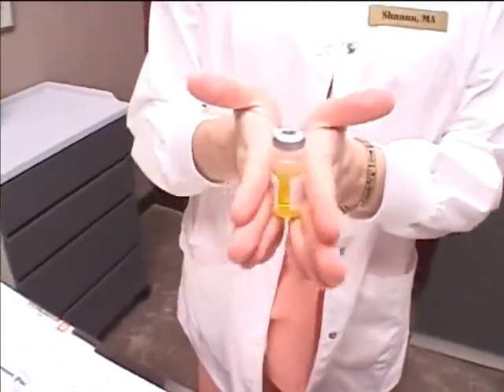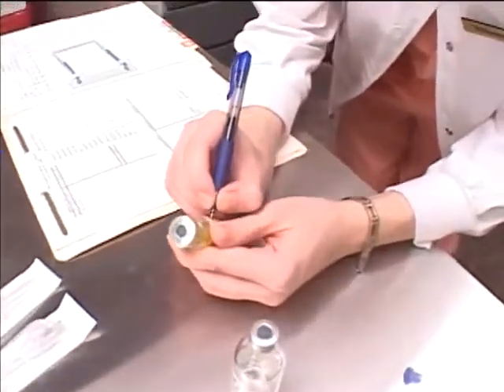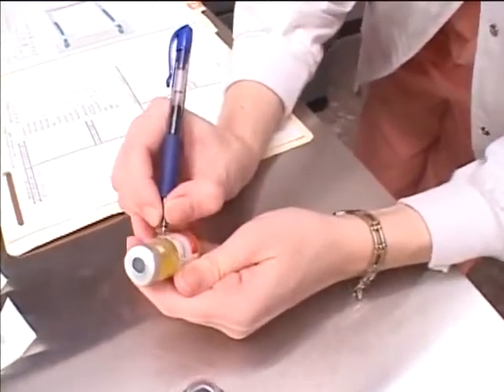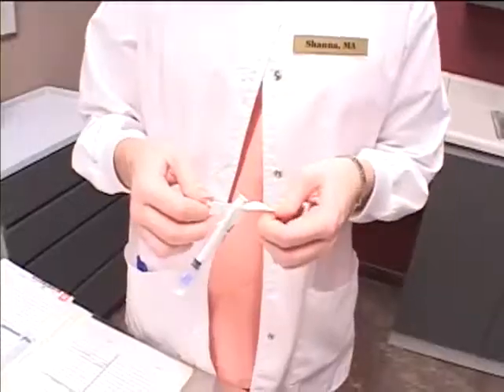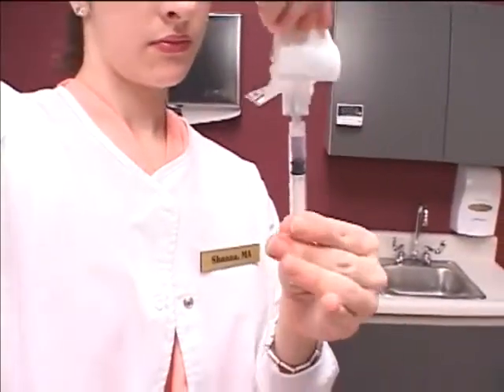Roll the vial between the palms of your hands to mix. Label the vial dilution of the medication with the date, time, your initials, and the expiration date. Clean the mixed vial with an alcohol swab. Assemble the syringe and needle according to institutional policy.